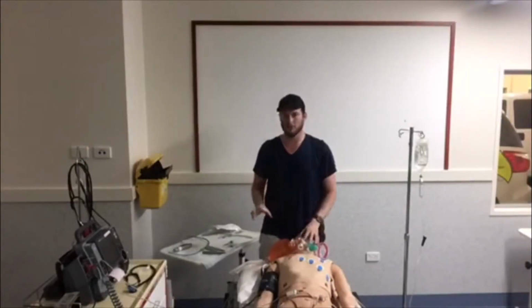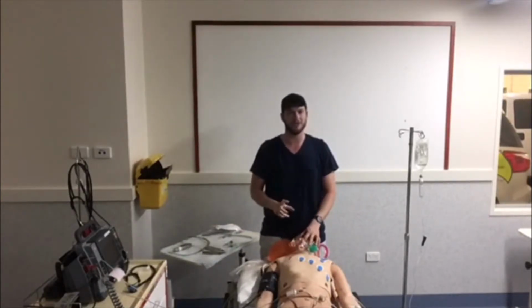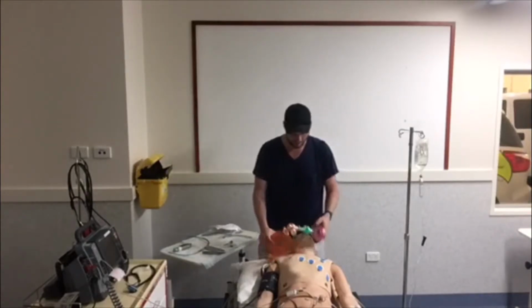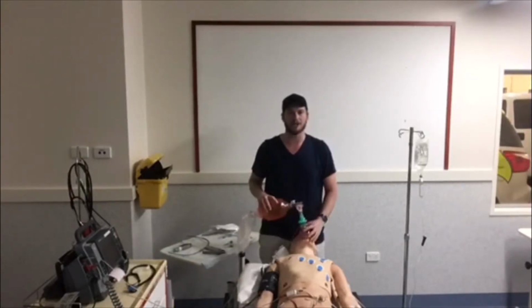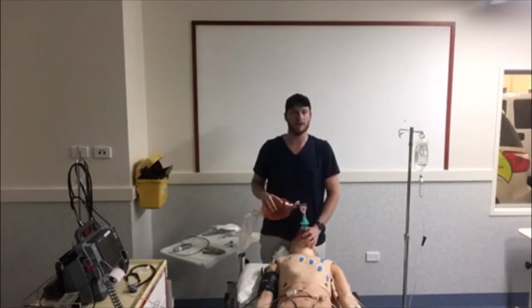Now once we've understood what kind of airway equipment we're using, we can move over to positioning of the patient. Now we've already done a video demonstration on positioning, just making sure the head's up a little bit, and if they're quite obese, ramping underneath their body, just aligning those axes, just to make sure you're doing really good forward planning of this. So at this stage, we're still pre-oxygenating the patient with those nasal prongs at high flow and also a bag valve mask as well.